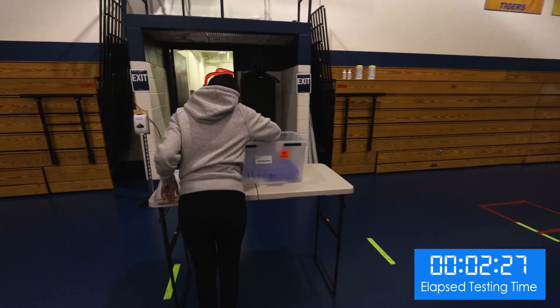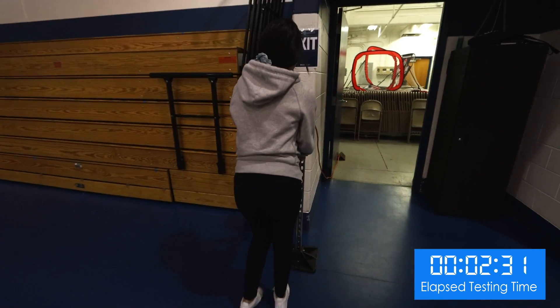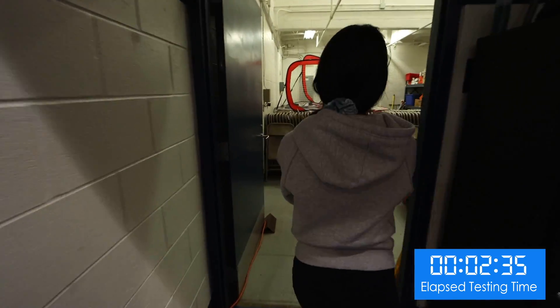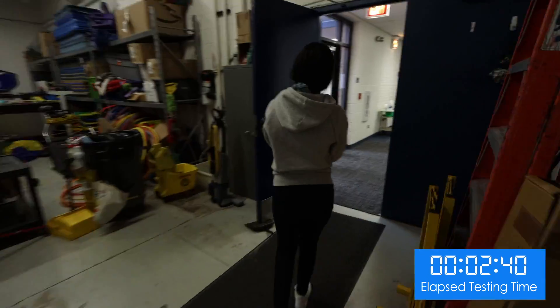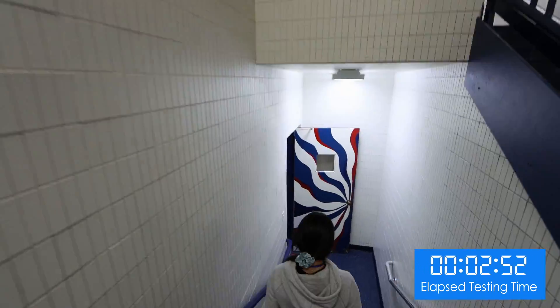She places her test tube in a collection rack, then sanitizes her hands once again, and leaves the collection area to return to her classroom. The student is the only person at the collection site who ever touches the test tube to prevent contamination.